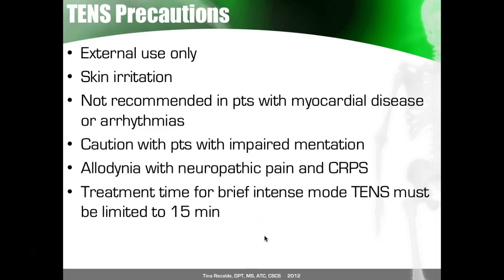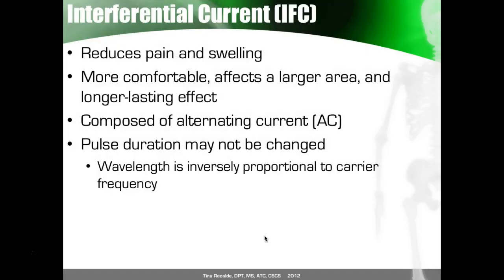Okay. So then we have interferential current, which is IFC. I'm going to do that as a separate video. So that's the N for TENS.